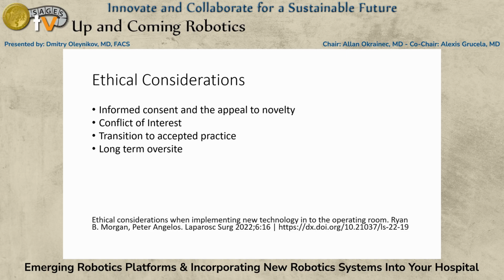And then, of course, there are ethical considerations. You have to get informed consent. And if the informed consent is, I've only seen this thing one time before, and I've never done one of these, that ought to be part of the discussion. You have to disclose conflict of interest. If the company is paying you to use their device, you should say something to your patients.